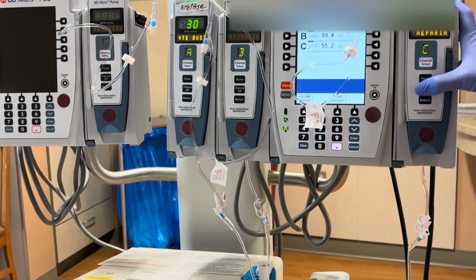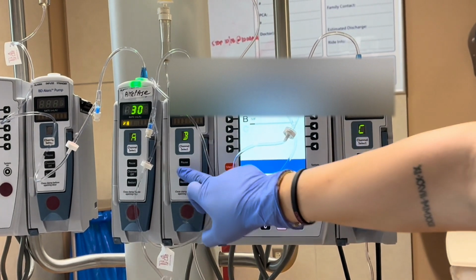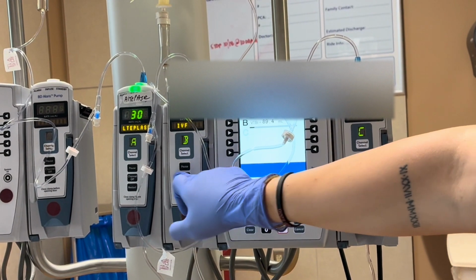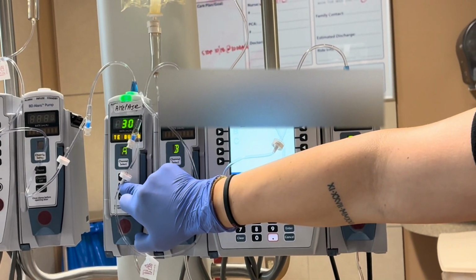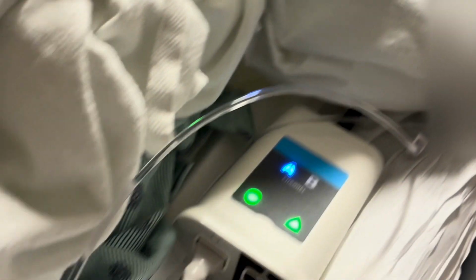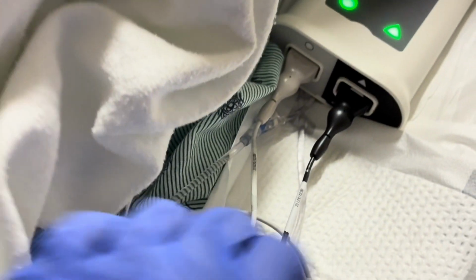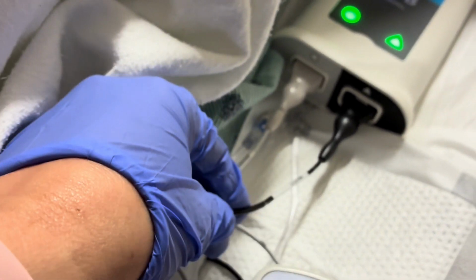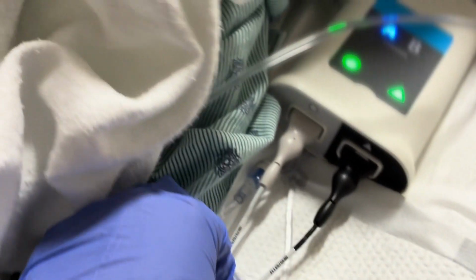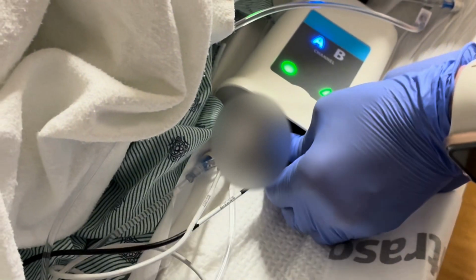Okay, so Jamie's gonna turn off the 3 infusions. And we are actually gonna take the black electrical cord. This is your actual EKOS catheter that delivers the electricity. If you could pull that off, Miss Jamie, I'll have you do that.